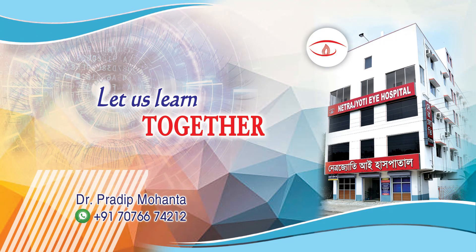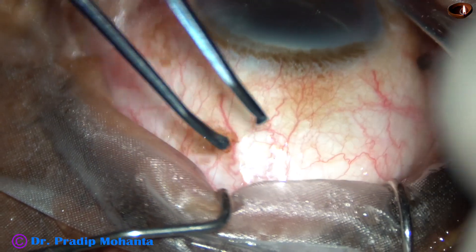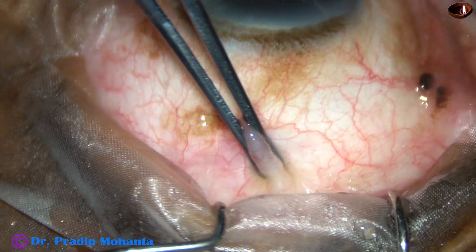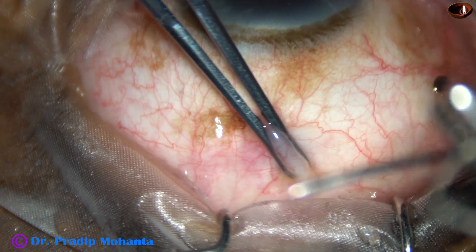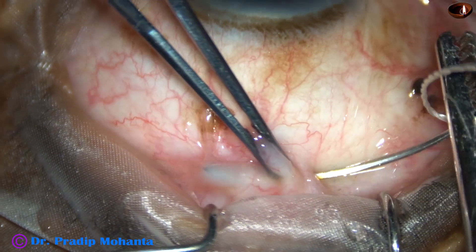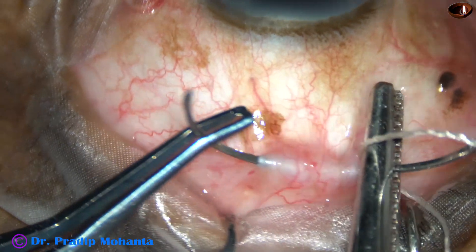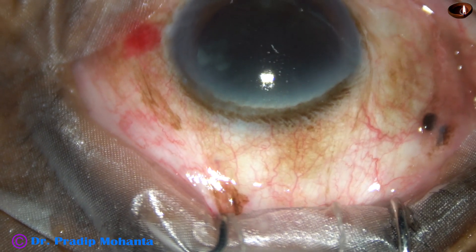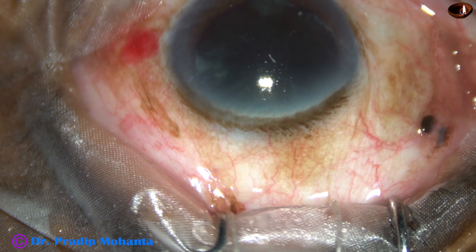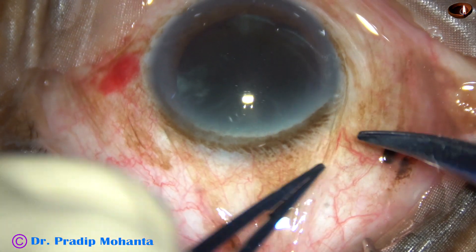Friends, welcome to my workplace at Ranagh Heart, West Bengal, India. This is a very hard cataract — cataracta nigra, or black cataract. In this case, I was hesitant to do phacoemulsification and I have planned Double SICS. Double SICS means two SICS wounds, 5 mm each, are placed side by side and one suture is applied joining these two SICS wounds. This is about 10 mm.